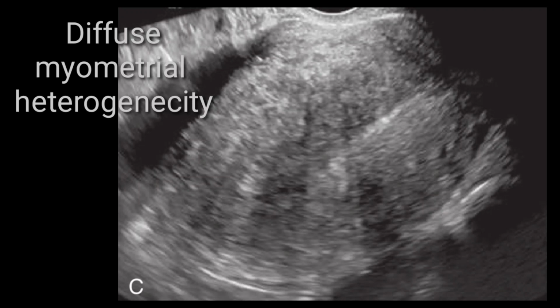Many a time clinicians write that there is heterogeneous myometrium suggestive of ill-defined fibroid activity, which is also right, because many a time you cannot differentiate fibroid because of its ill-defined margins. But the second possibility and the differential would be adenomyosis. If you cannot see any outline, as we can see in a fibroid, then there is a likely possibility of adenomyosis.